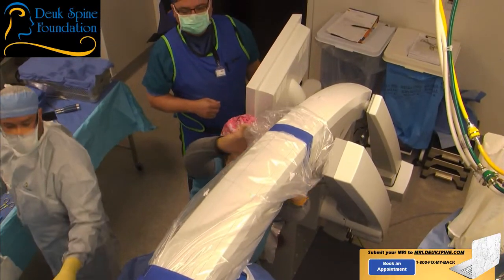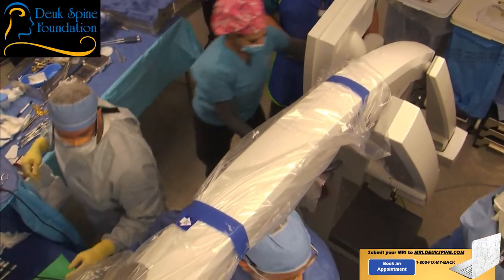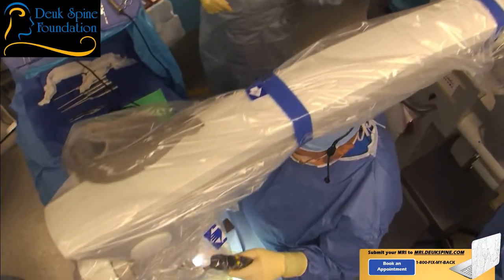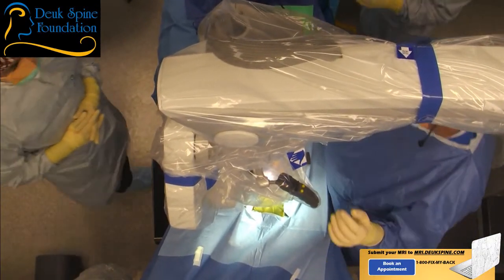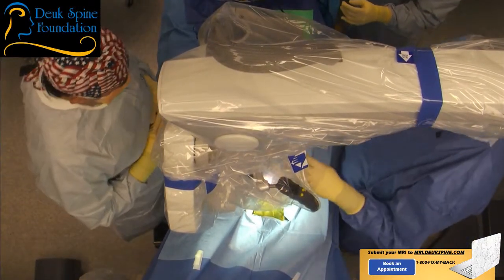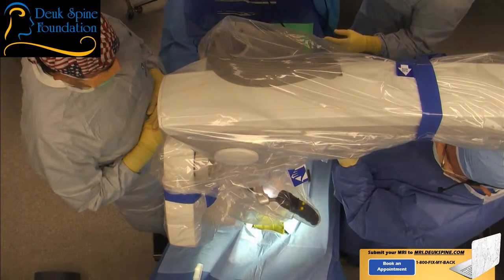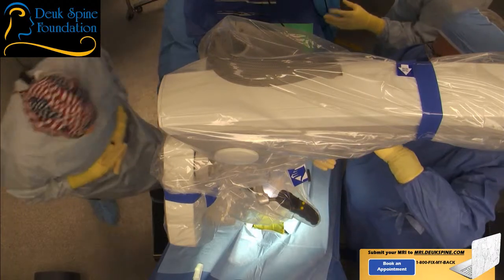All right, I need the base in 12 inches towards me and the anesthesiologist. That's perfect right there. That's good. All right. So in a minute, you guys are gonna be able to see through the microscope with me and Dr. Patel. And we're gonna be able to see inside the disc.